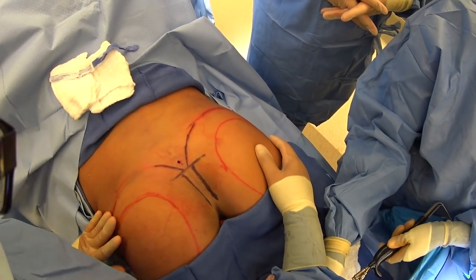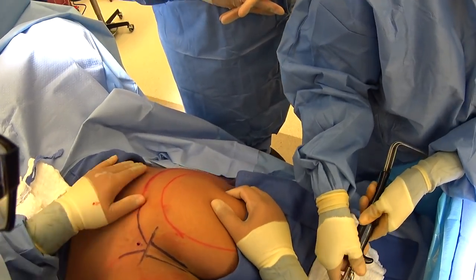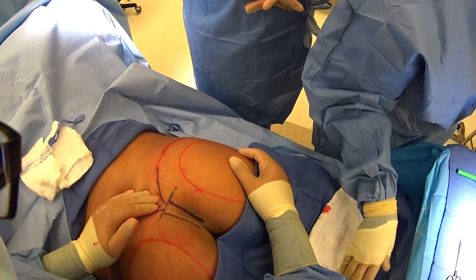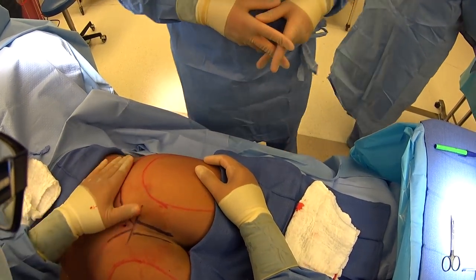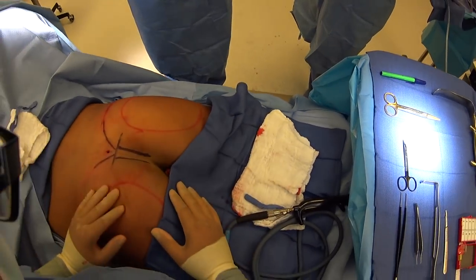Here we are doing our butt augmentation. We've already finished all of our liposuction of her love handles, flanks, and back area. You can even see a little hole here where we lipoed this little sacral fat pad. We've marked out where her butt is — this is where her butt implants are going to go. You can see the circles here.